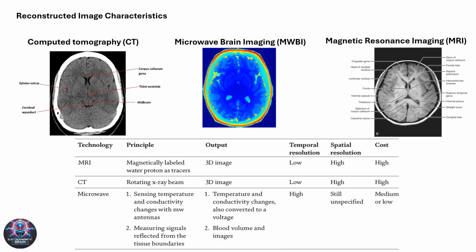Portability is where MWBI stands out. MWBI devices are compact and can operate outside traditional hospital settings, offering great potential for mobile diagnostics and monitoring in remote or resource-limited areas. In contrast, CT and MRI require large, stationary systems, as depicted in their respective images.